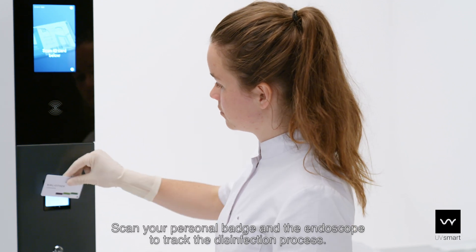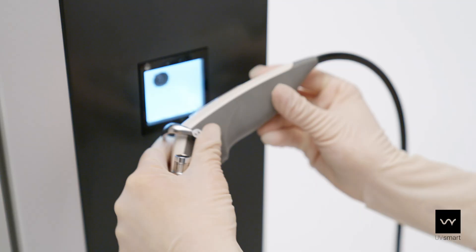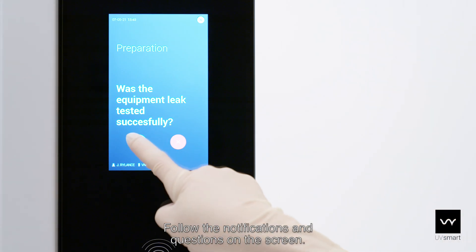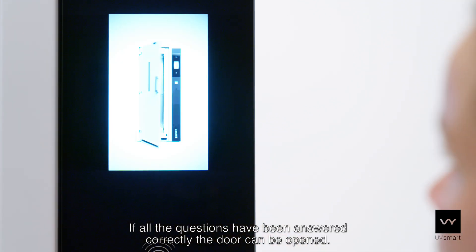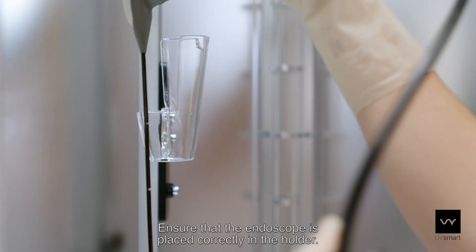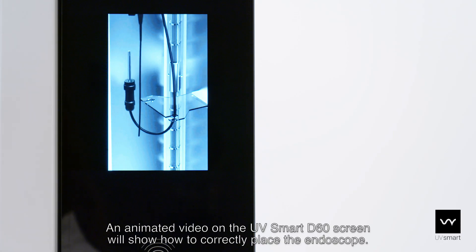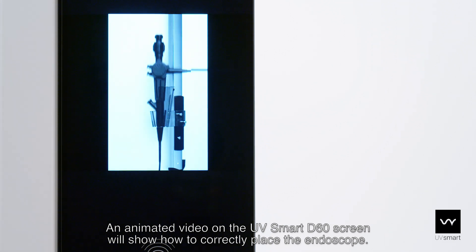Scan your personal badge on the endoscope to track the disinfection process. Follow the notifications and questions on the screen. If all questions have been answered correctly, the door can be opened. Place the endoscope in the UV Smart D60. Ensure that the endoscope is placed correctly in the holder – an animated video on the UV Smart D60 screen will show how to correctly place the endoscope.